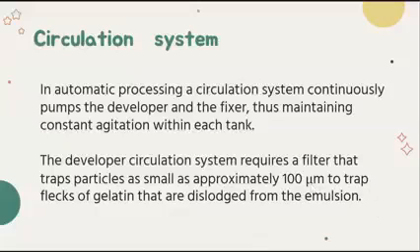These filters are not 100% efficient, therefore sludge can build up on the rollers, and we don't want sludge to build up in the rollers because it can damage the film. Okay. So because of the 100 micrometer filter, particles have a lesser chance of not only attaching to the rollers but also attaching to the subsequent films processed by the radtech.